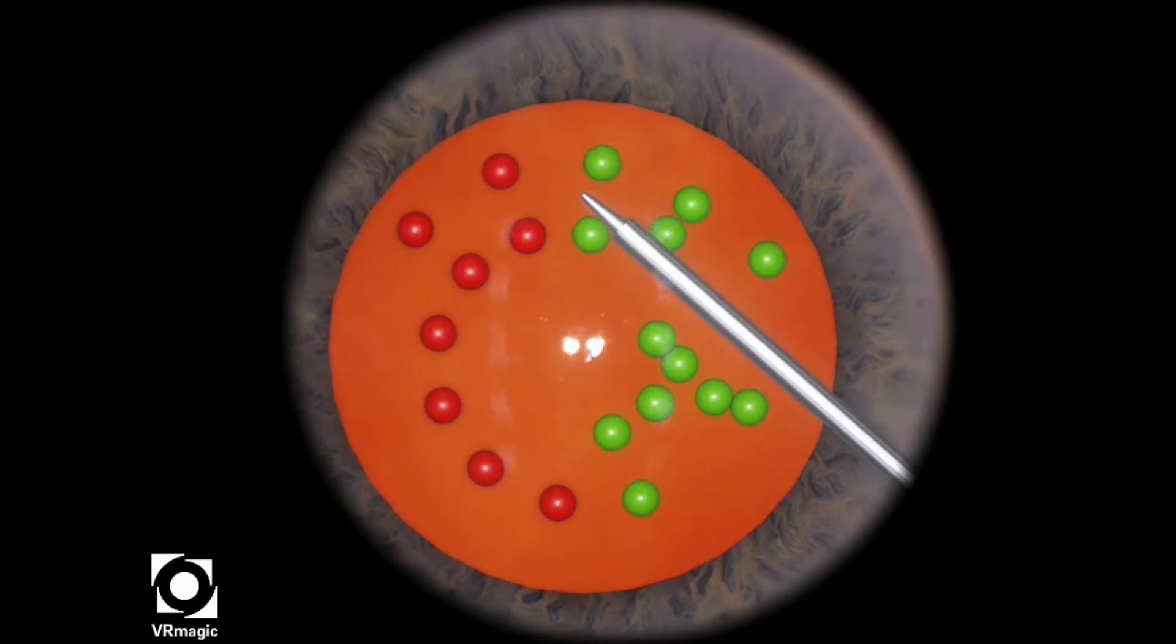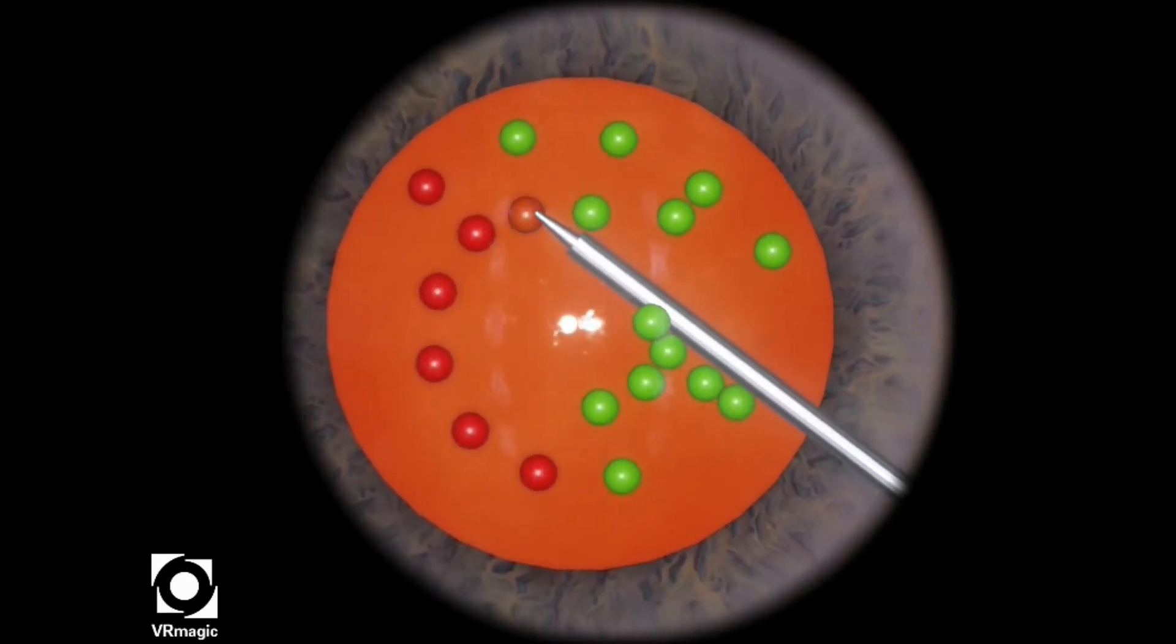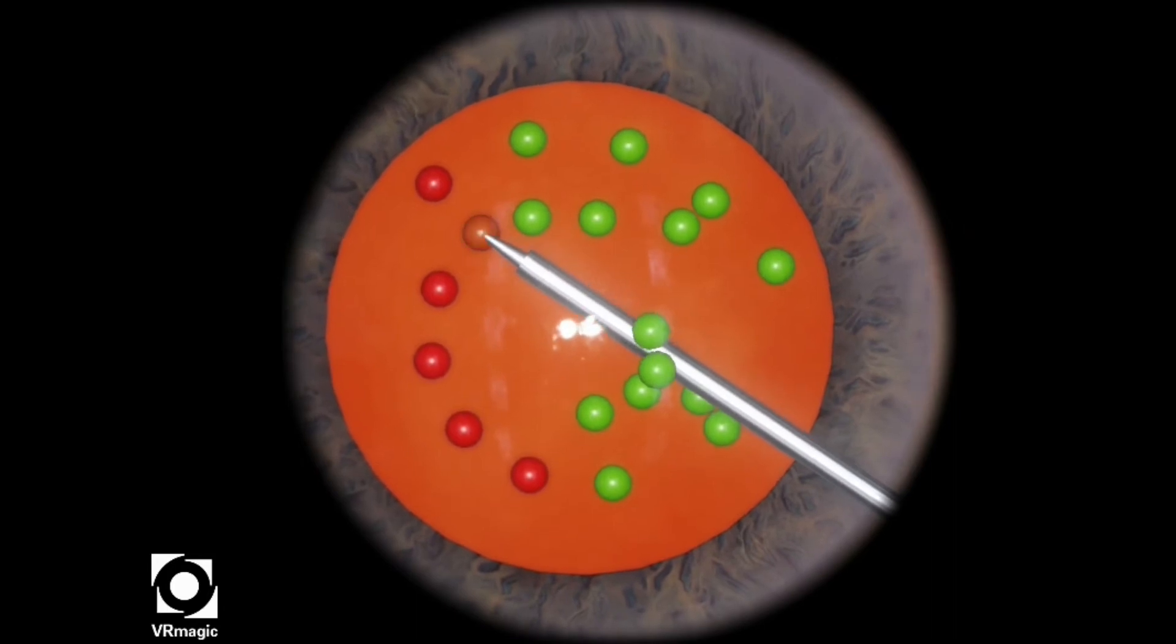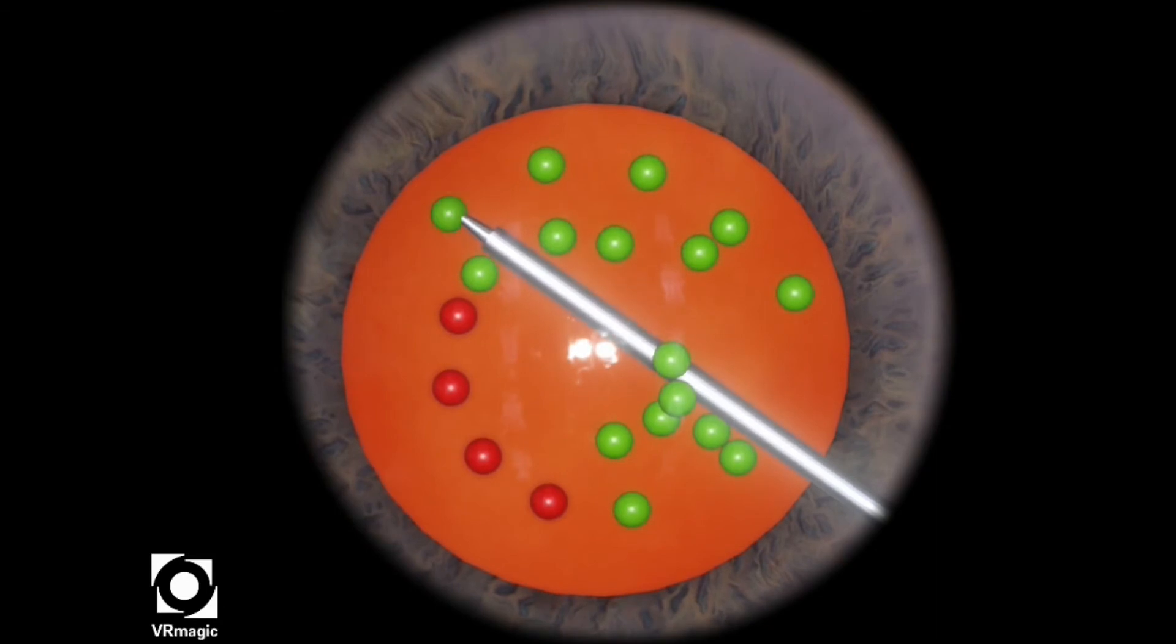So starting from the right all the way to the left. So that way, I don't accidentally move my tip over a sphere I didn't intend to shade and get points taken off.